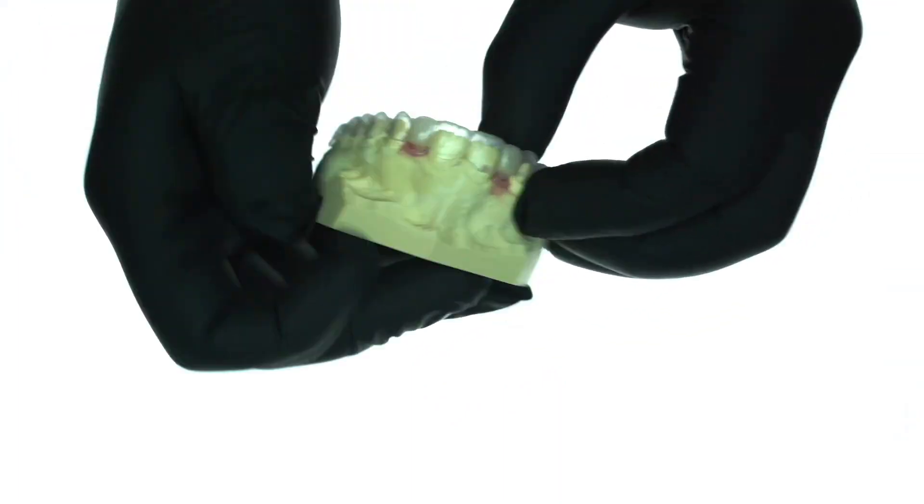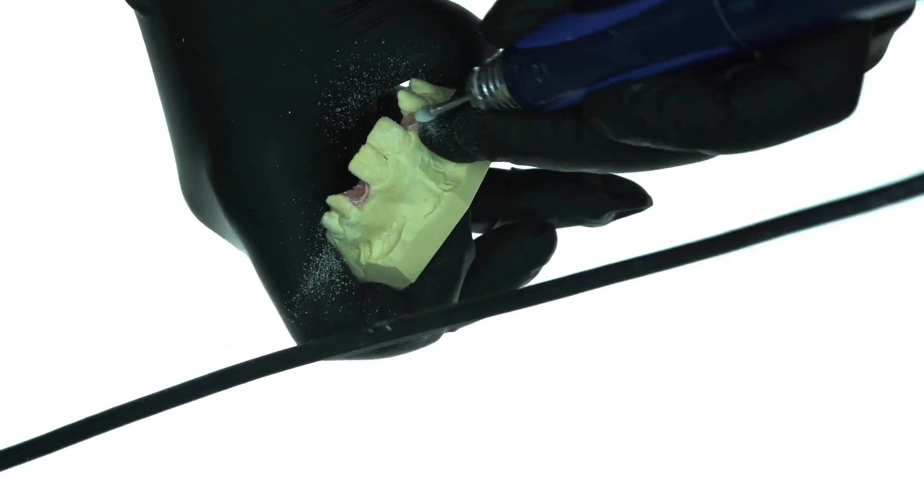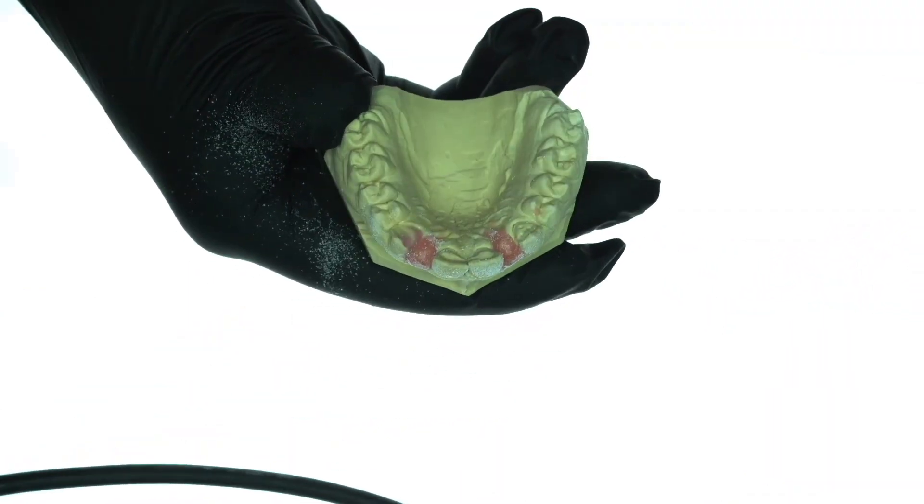Very small modifications of the emergence profile are made, and now the master model to produce the restoration is ready.